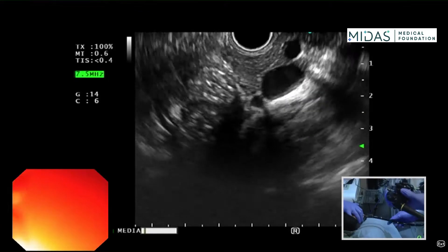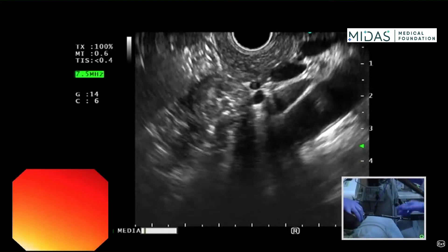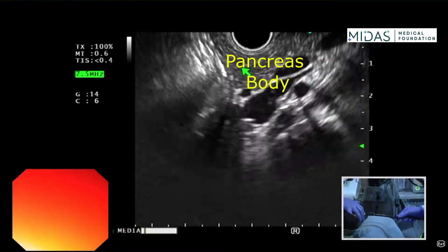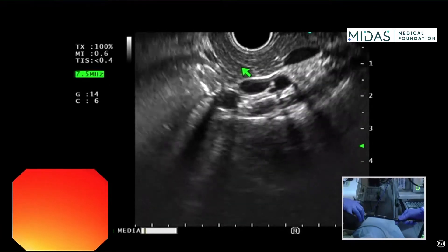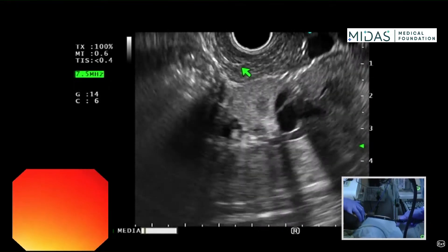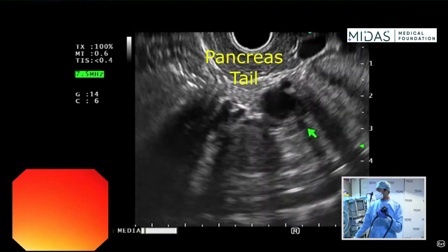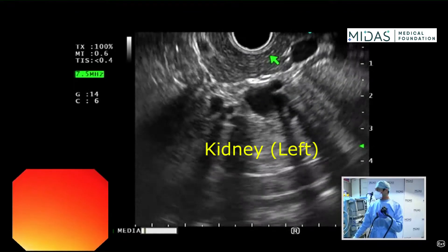Then do a slow, steady clockwise torque and follow the pancreas. With big wheel towards me and suction, continue clockwise torque. What you have now reached is the tail of the pancreas, because you can see the kidney here. This is the left kidney, and this salt and pepper structure is the pancreas.